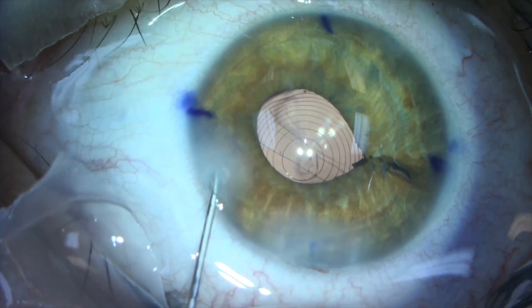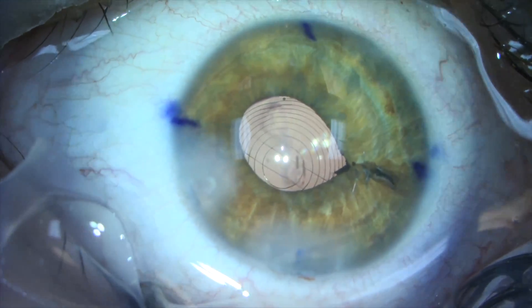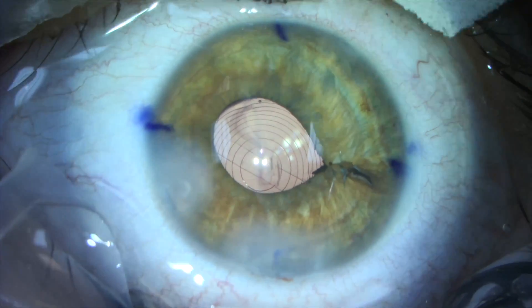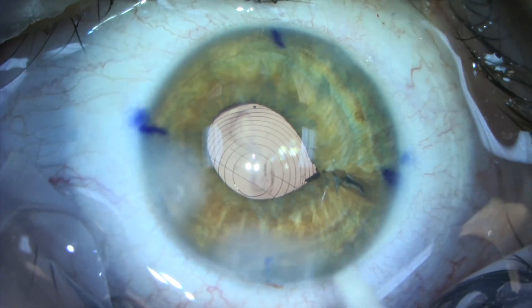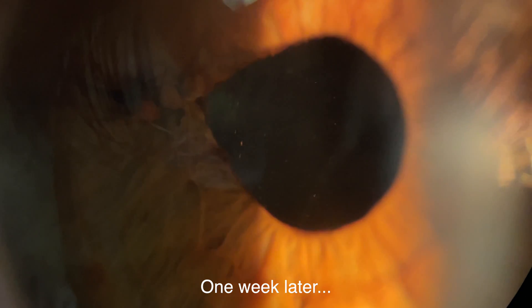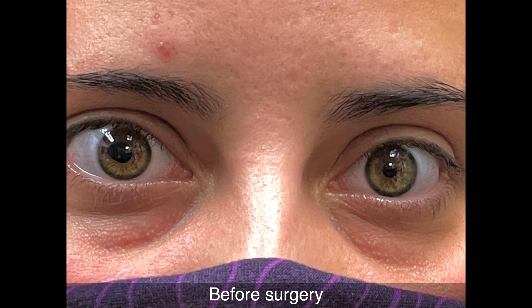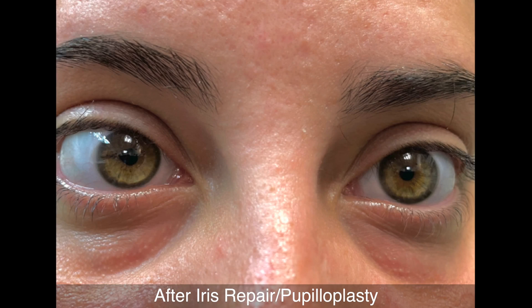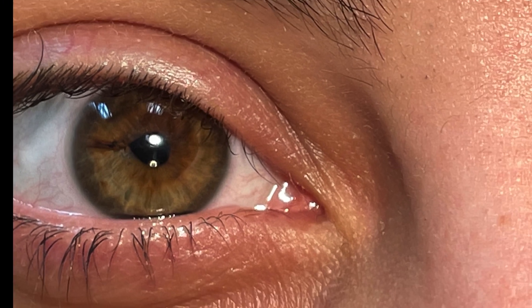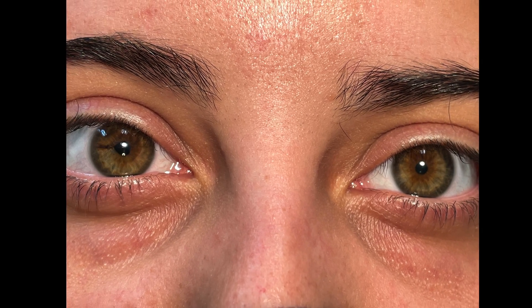Here is the appearance of the iris and pupil at the end of the procedure. Our goal was to match the size of the right pupil with the size of the left pupil for optimal cosmesis. The patient noted significantly improved vision and reduction in glare and light sensitivity. Prior to surgery, she could not go outside without wearing sunglasses due to glare from the dilated pupil. Now with a normal size pupil, she's able to see better and experience a more normal life.